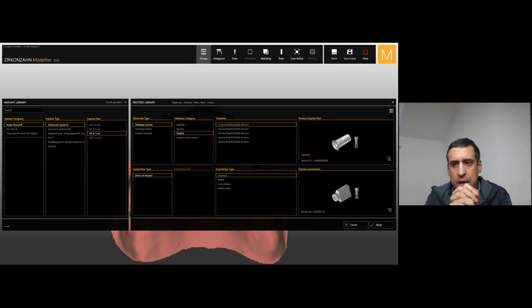And let's say the K85 is the large T-base that you can use when you have large crowns or large bridges, just to be safe. And you can see that you can cut it at a different level. If you choose the height here, for example, 5 by 4 or whatever, and you select it, it will automatically fit when you cut the T-base at that level.